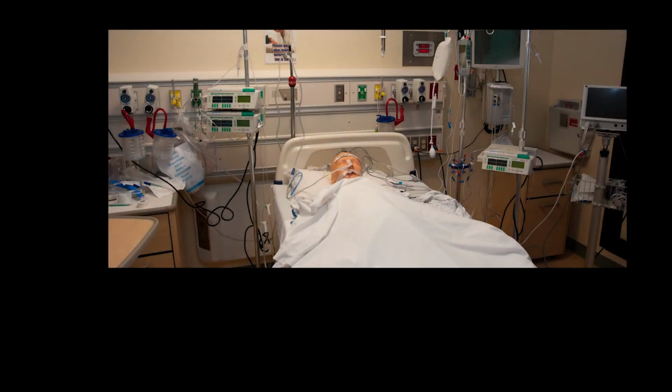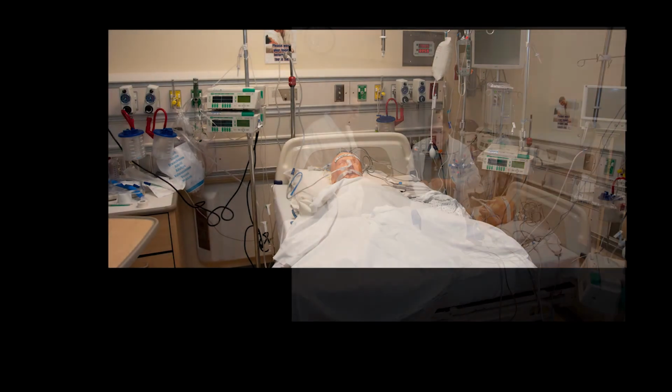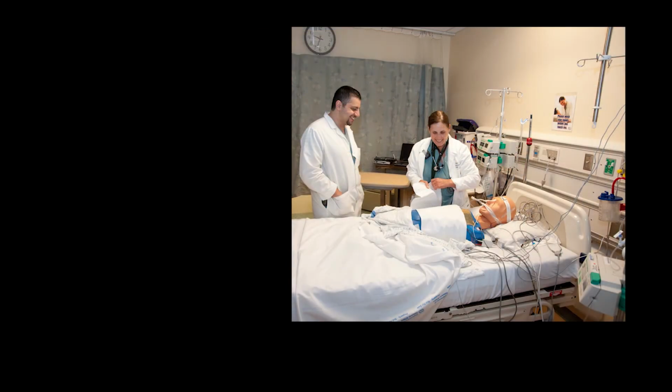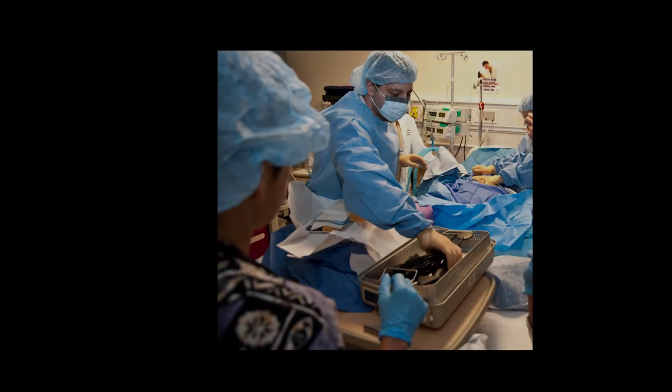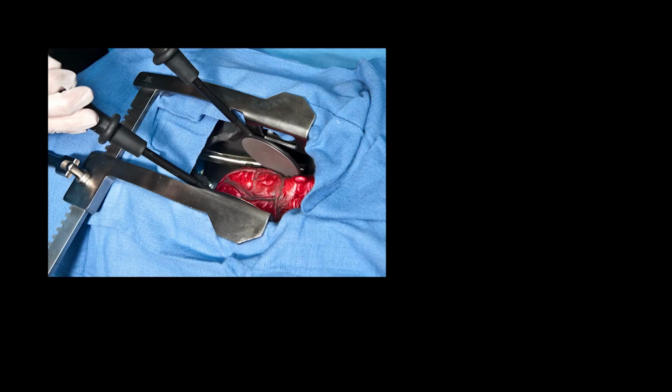Key to success of the simulation went beyond just the mannequin. The simulations were conducted in an empty ICU patient room with as much of the usual post-open heart equipment as possible. This included pacemaker box, ventilator, chest tubes, IVs, and internal defibrillator paddles. By combining a valid and reliable audit tool with a realistic simulation, we were able to document and improve team competency in this procedure. The first mock code performed by the team took just under 18 minutes.